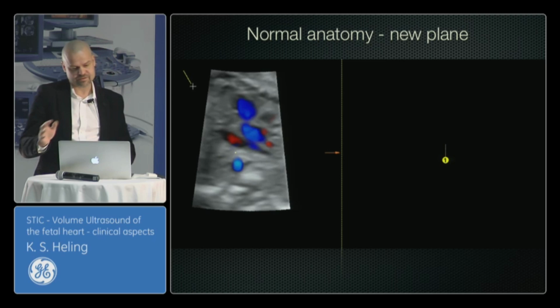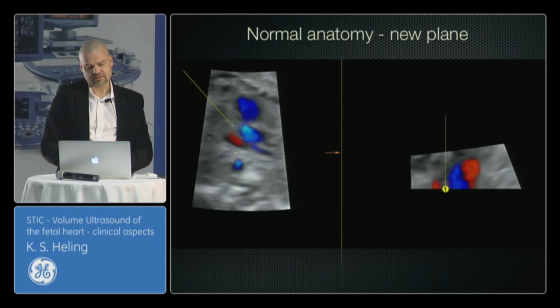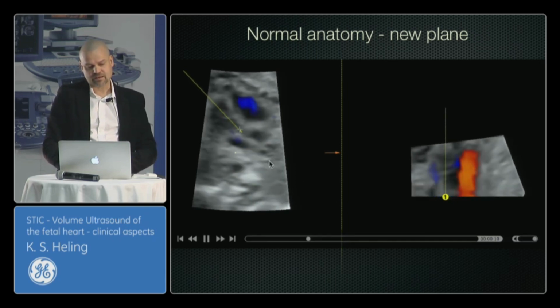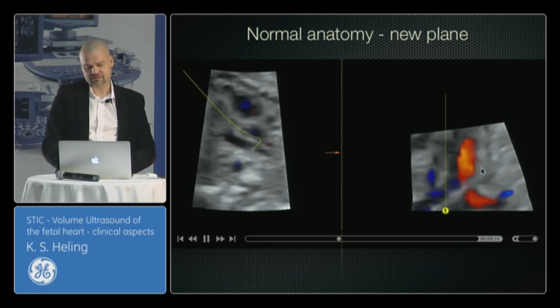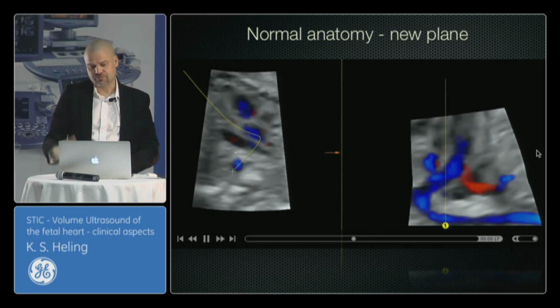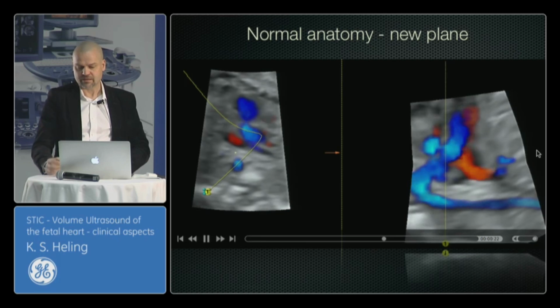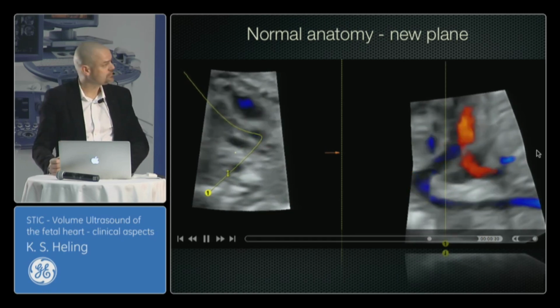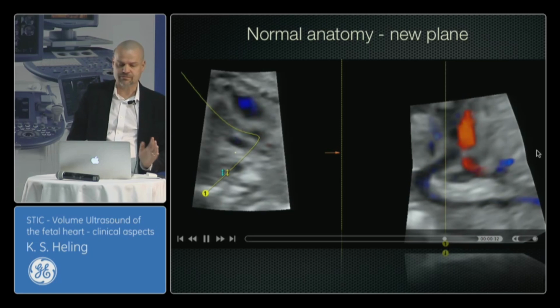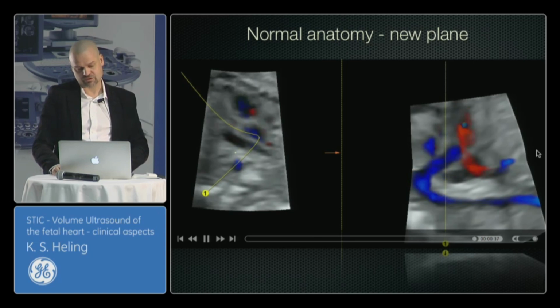And Rabi showed you this OmniView, and when we draw this virtual line through the left ventricular outflow tract, I put the line directly into the left ventricular outflow tract, and on the right side you see what happens. And virtually we rebuild easily the aortic arch. And okay, it is a nice tool, but for people who want to train fetal echo and who want to learn fetal echo, it is easy to understand how the different structures of the fetal heart are to each other.